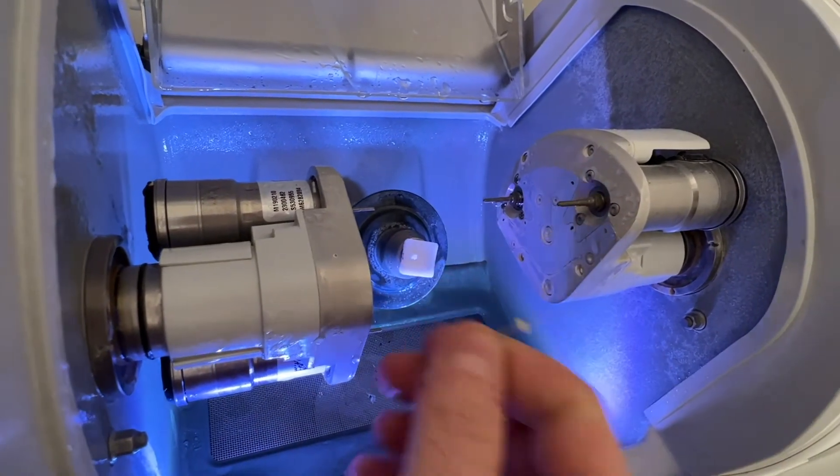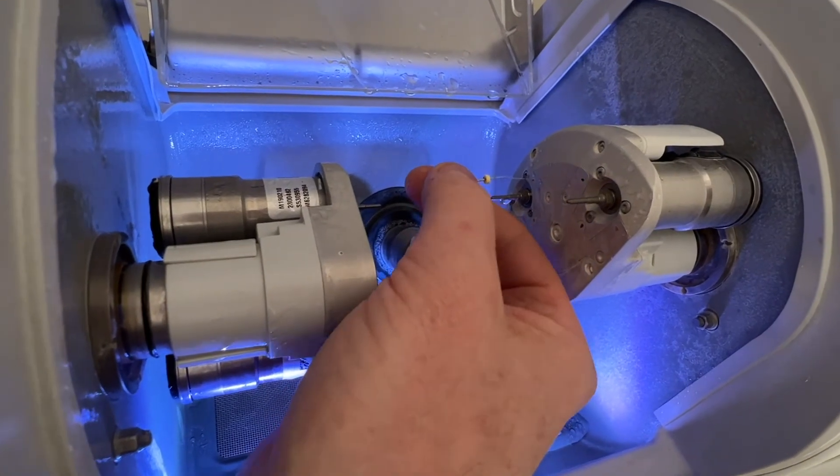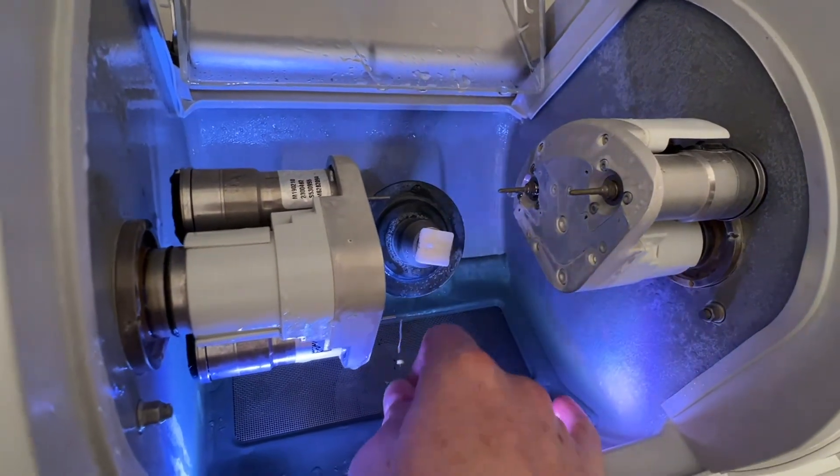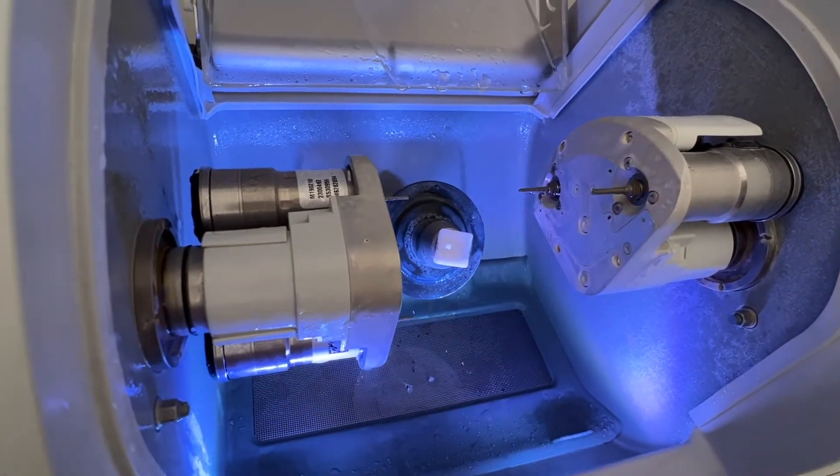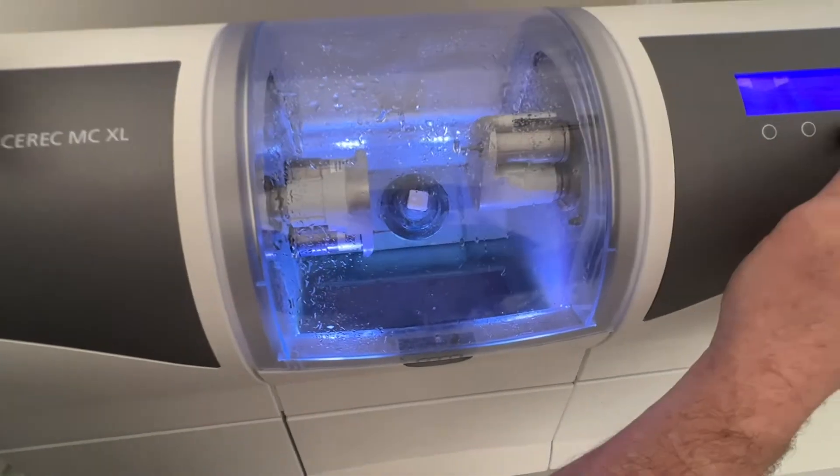Zirconia produces all sorts of gunk everywhere, not just in here but down there below where the drain is. So we need to make sure that these jets stay really nice and clear to be able to mill properly.